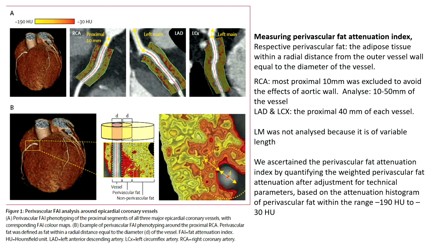You can measure it in the different vessels. What you see here is that you got different software. This software works with taking little pieces. Eventually, I think, little pieces, as you see on the CT scan, is working where there is already stenosis. That's not what we want. We want to go earlier. We're not going to look for stenosis on the CT scans and then do this analysis. We're going to take vessels where we do not see much.